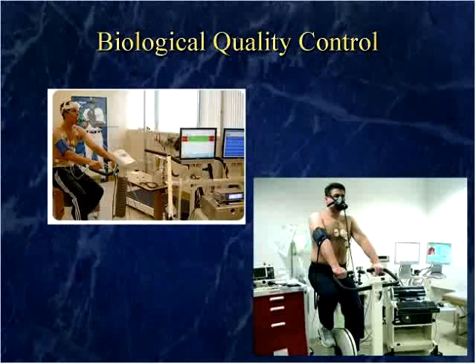Biological controls have been very popular in other testing modalities. They're becoming popular in exercise testing also, because that's the only way you can really put it all together. Is the cycle ergometer working correctly? Is the gas exchange system working correctly? A lot of research studies are requiring this now as we move into the environment of looking at cardiopulmonary exercise testing as a research modality.